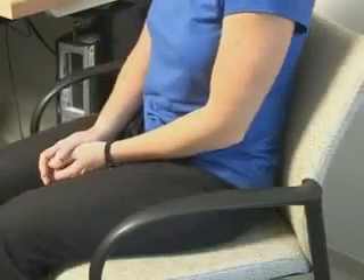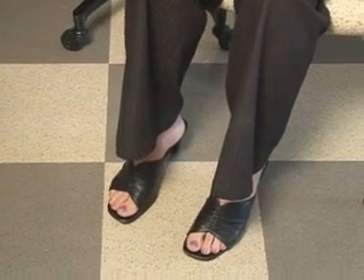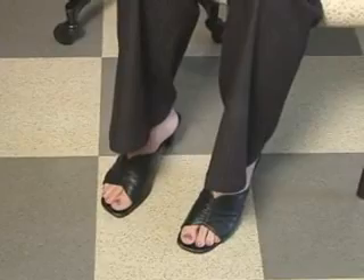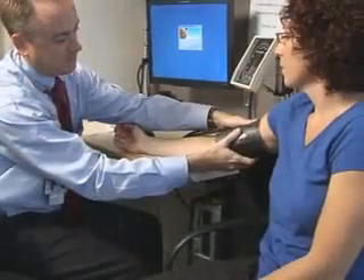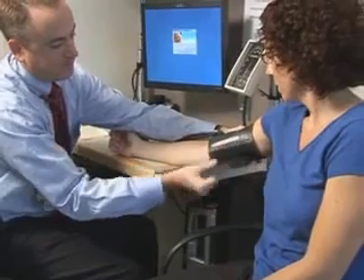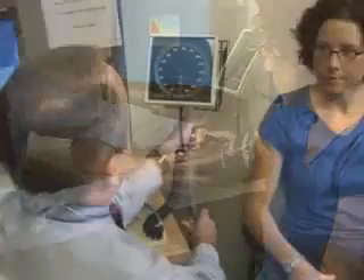Correct positioning of the patient is essential to accurately measure blood pressure. The patient's back and legs should be supported, with legs uncrossed and feet resting on a firm surface. The patient's arm should be bare to the shoulder. The arm should be supported at heart level. The manometer should be at the eye level of the healthcare practitioner.